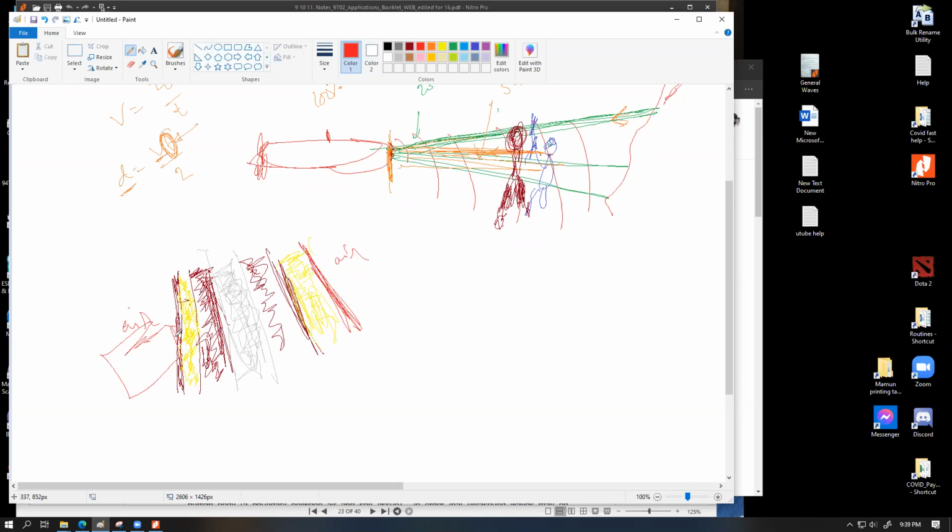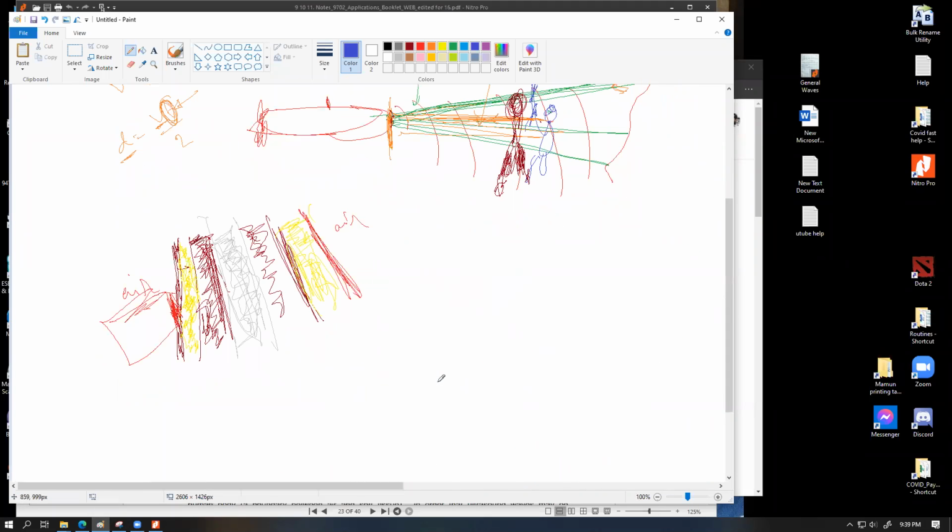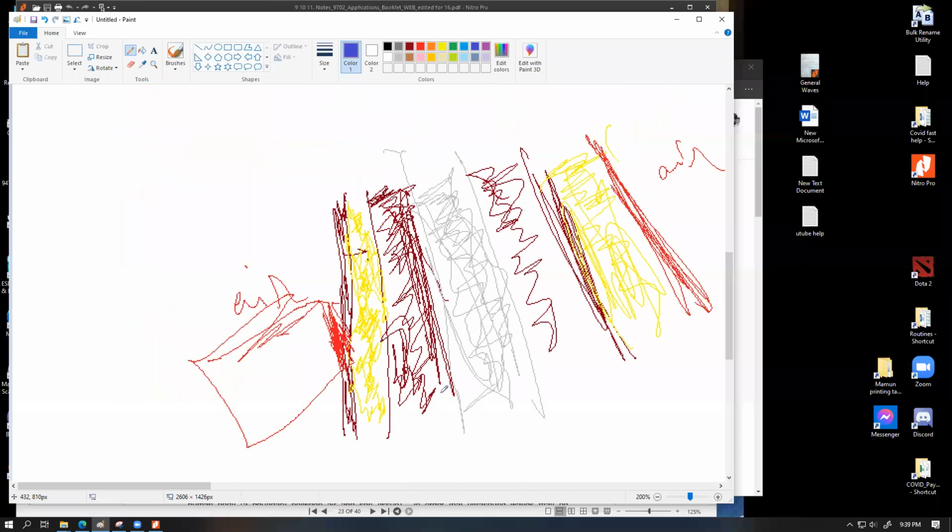We need to have some gel over here to reduce the impedance, but I'll talk about the gel a bit later. Imagine we put the ultrasound source here, so from here we will produce a high frequency sound. So here's a part you need to understand. The ultrasound will enter. Let me use blue for this, and let me zoom in over here, so it might be a bit more easily understandable. So this ultrasound is entering from here into the body. It is going to first undergo a medium change from skin into fat. This is a medium change.